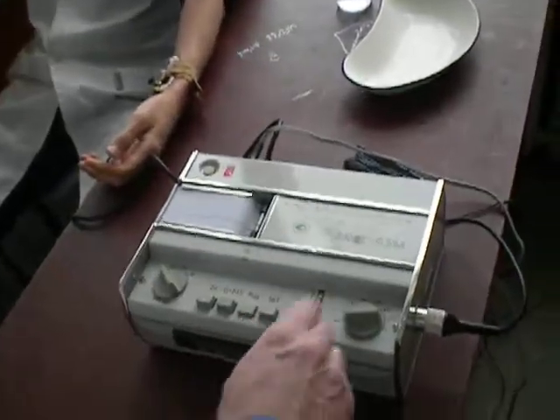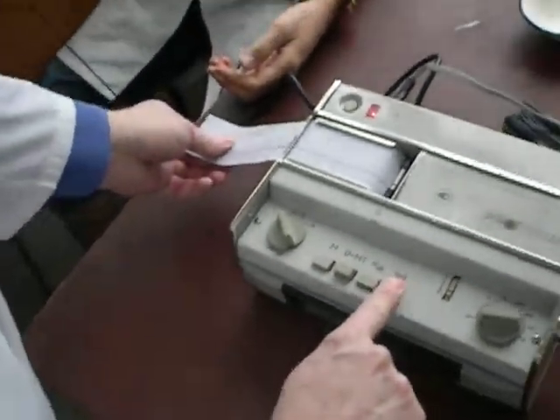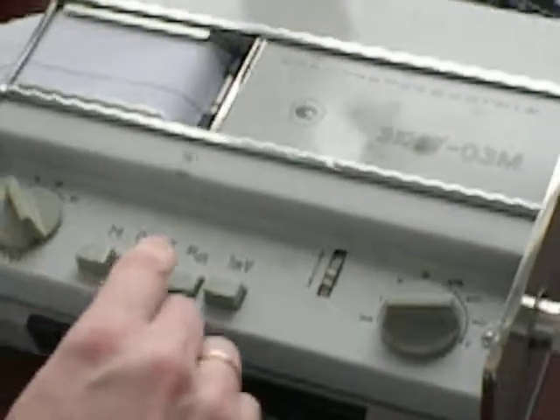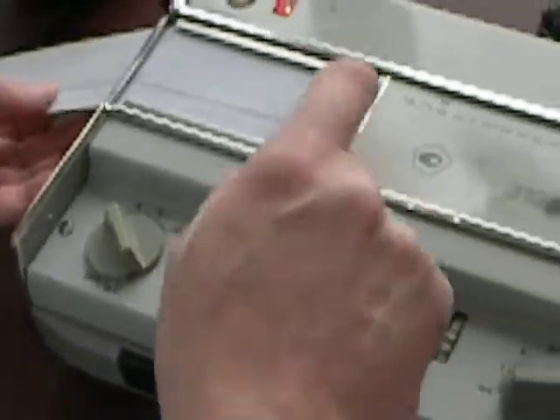So here, when we begin our study. First we have to... It's not working. This one is not working.